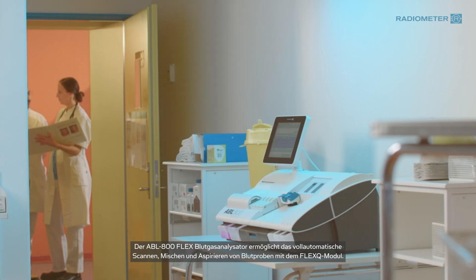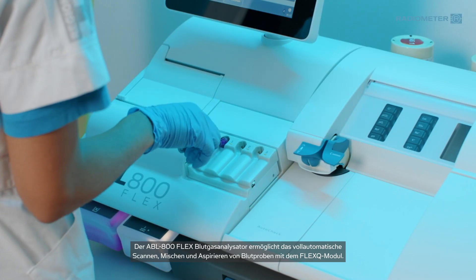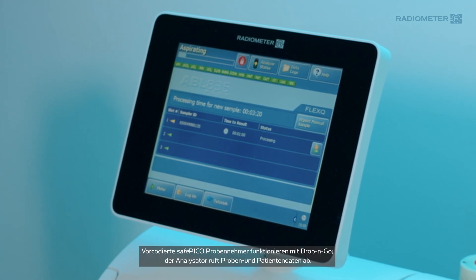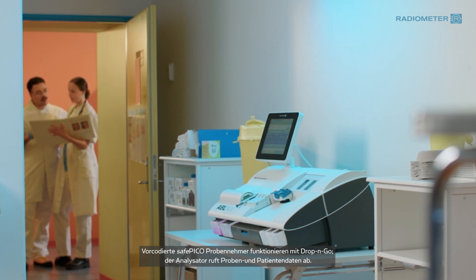The ABL 800 FLEX Blood Gas Analyzer enables fully automated scanning, mixing, and aspiration of blood samples with the FLEX-Q module. When using pre-barcoded SafePico syringes, simply drop and go — the analyzer retrieves sample and patient information.